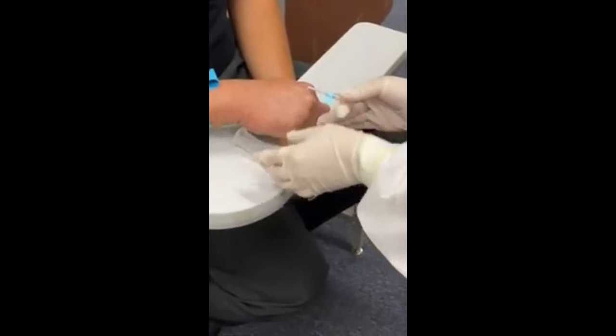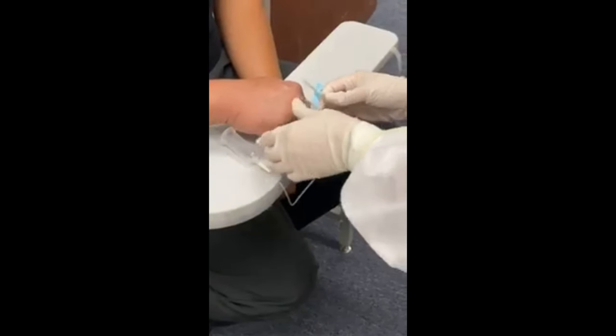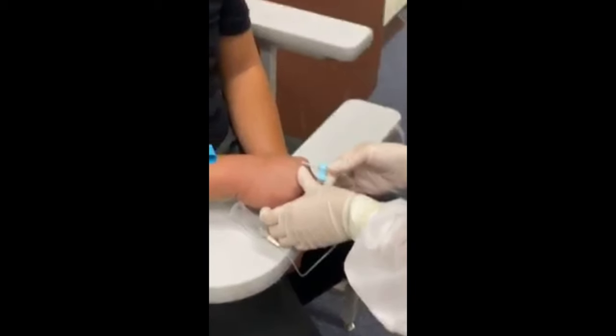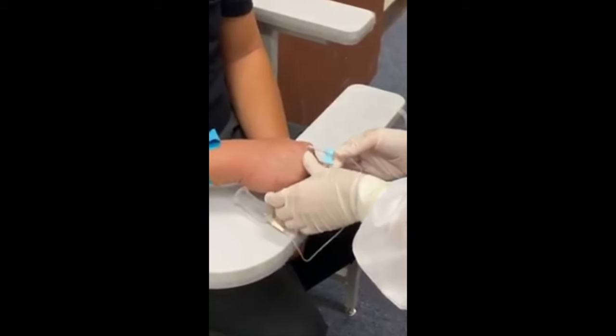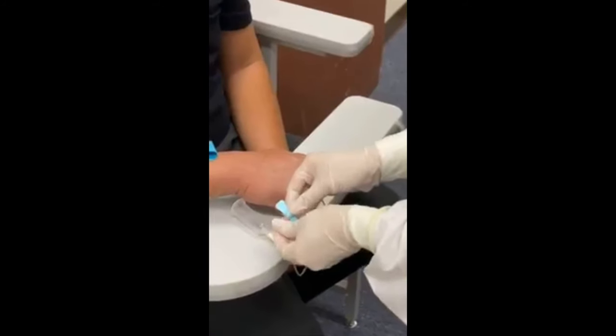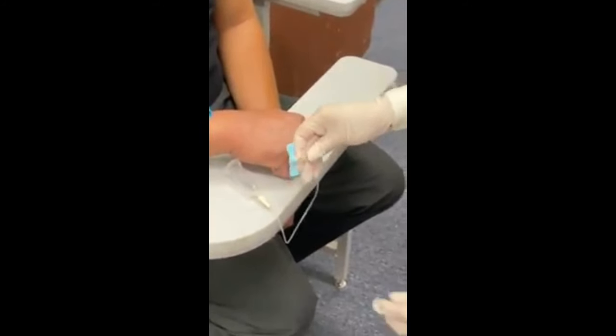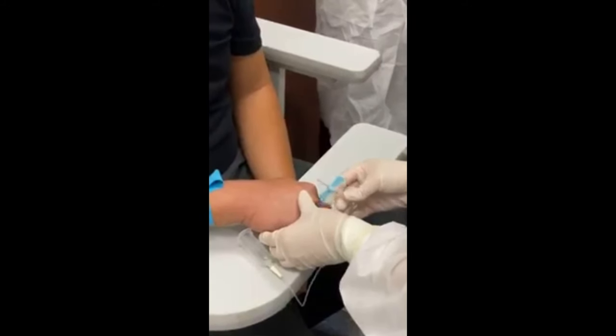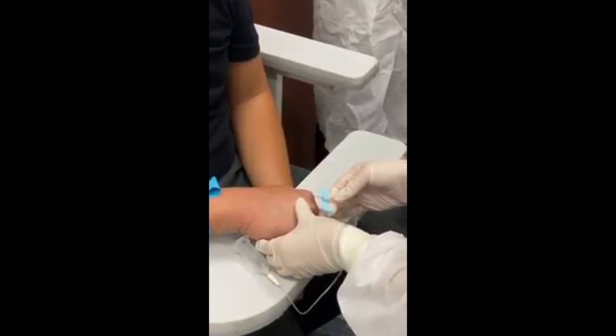Okay, so take your time. And whenever you're ready, you can remove that needle. Or you can even practice supporting and then practice going in. Okay, and then just keep in mind the black button. It can actually be pressed. So just take your time. Whenever you have support of my hand, and then you just go in.